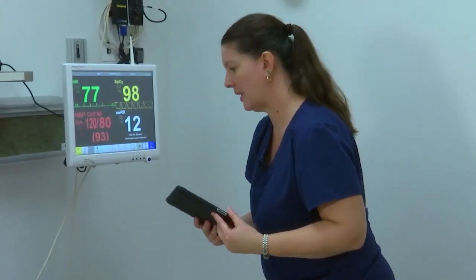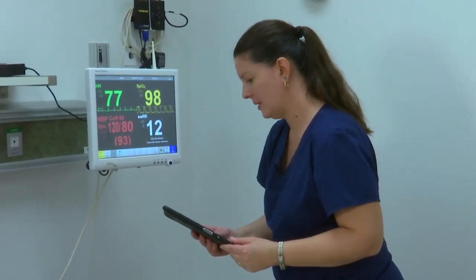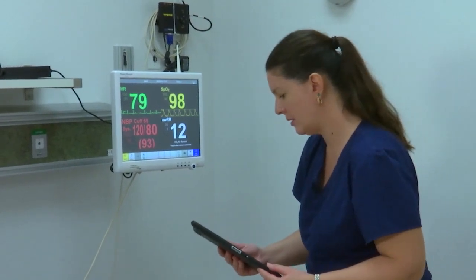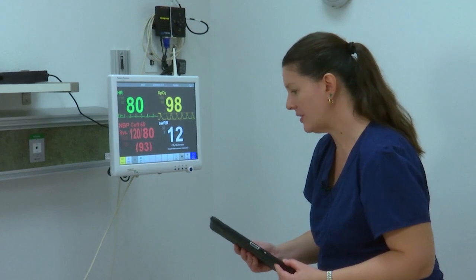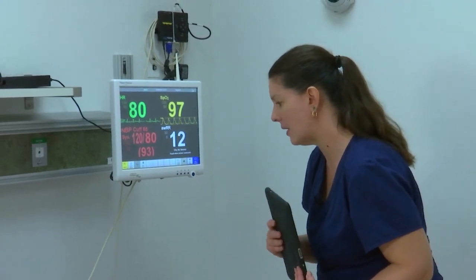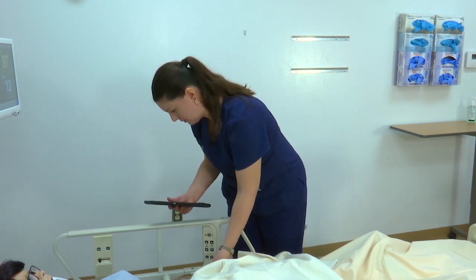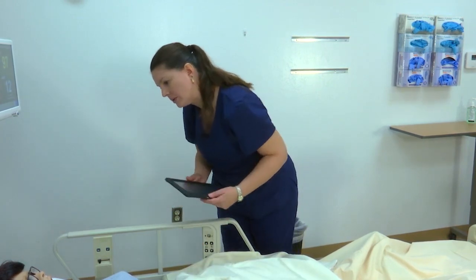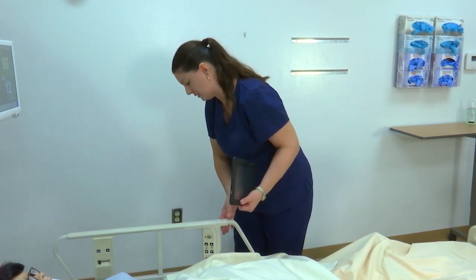I see that you're going to get a catheter today. That's just a small tube that's placed in your bladder. It'll help with any pain after the procedure, and it'll help us keep track of your urine count. I just need to make sure that you are indeed Ms. Perez. Notice how Christy checks the ID band to verify the patient's identity. Do you have any questions? All right, I'm going to go get all my stuff ready.